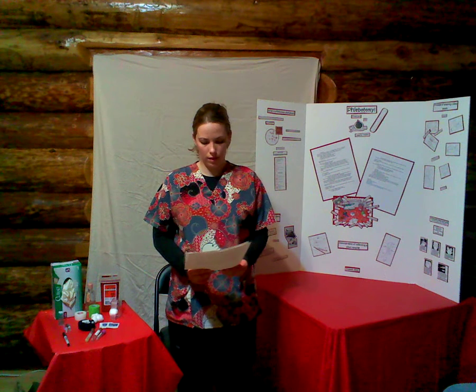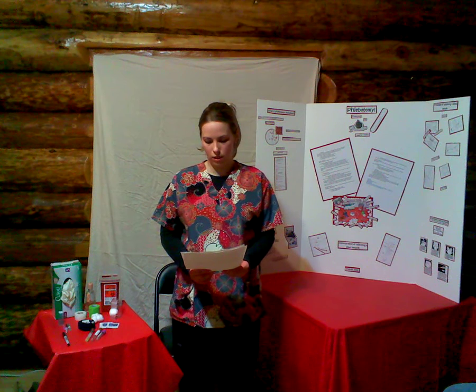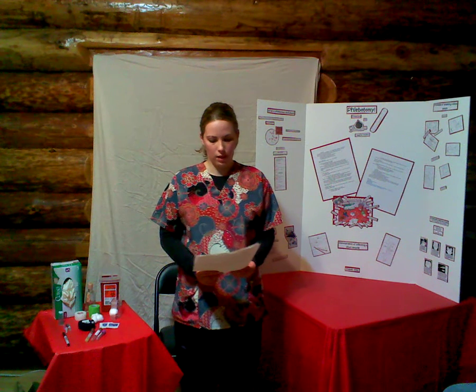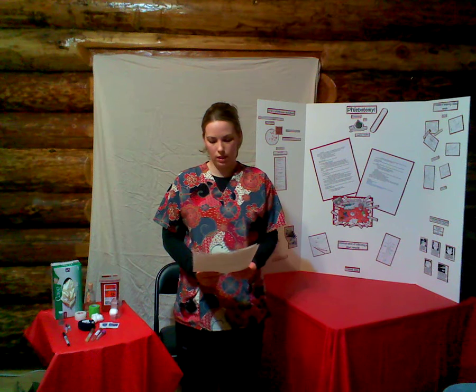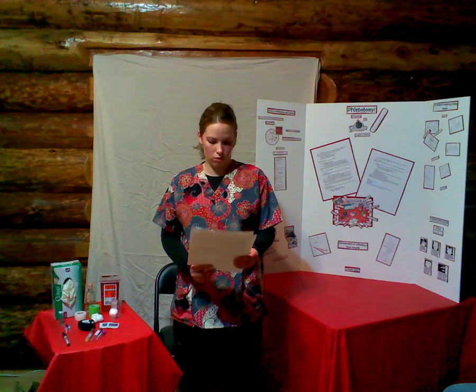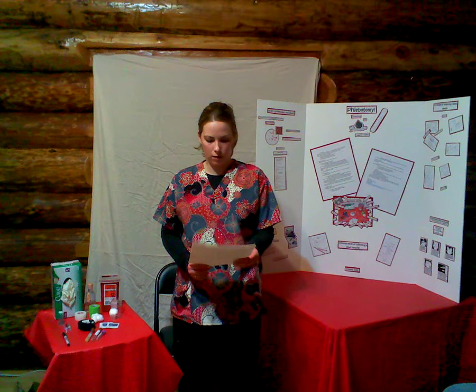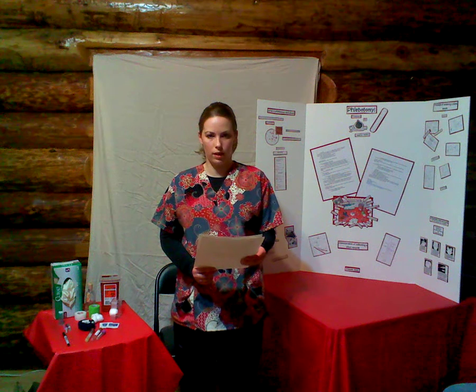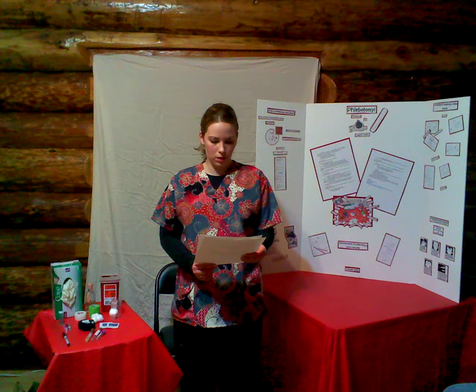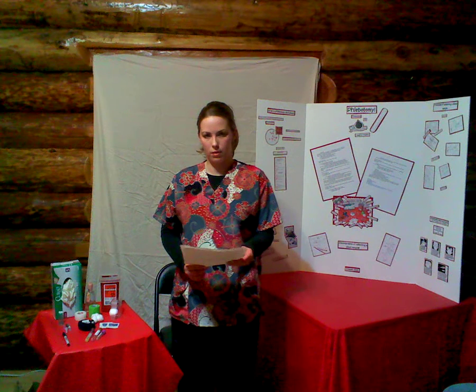What is a blood test? They're medical tests that analyze samples of a person's body fluids, tissue, or waste. Blood tests give important information to diagnose medical conditions, for health screenings, or to monitor treatment. Lab tests are one of the best ways for your healthcare provider to find out what's going on with your body. Now that we understand the importance of a blood sample, let's learn how to obtain one.